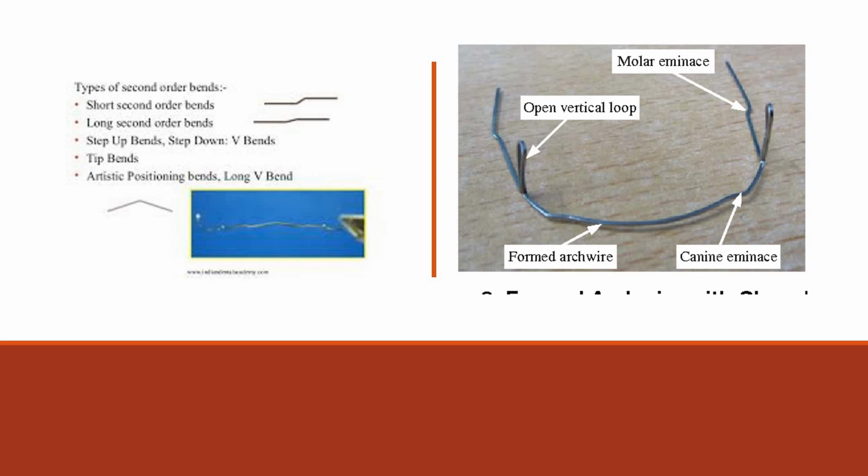The presence of these bends also meant that space closure had to be carried out with closing loops, which were also complicated to bend. In addition, teeth are moved bodily along the archwire through alveolar bone using an edgewise appliance, which is demanding upon anchorage.